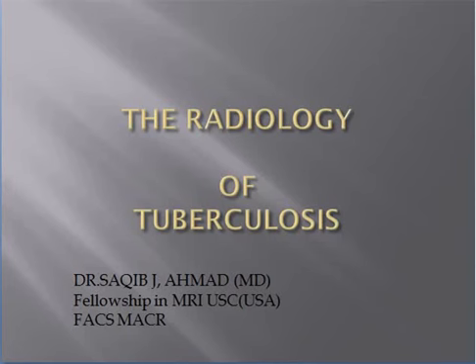Our today's discussion will be the radiology of tuberculosis. As we know, tuberculosis is still the most common disease as far as our cities or our country is concerned. And at the same time, we also know that tuberculosis can involve any part of the human body. So we'll discuss it in two segments, part 1 and part 2.